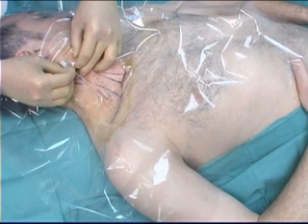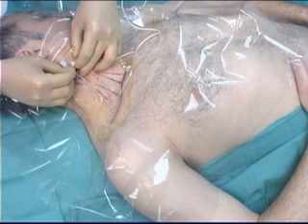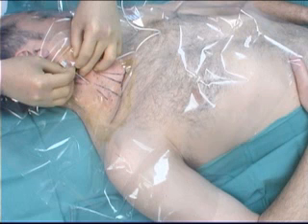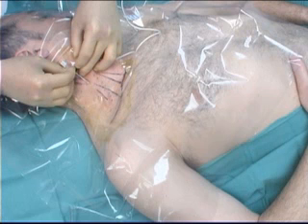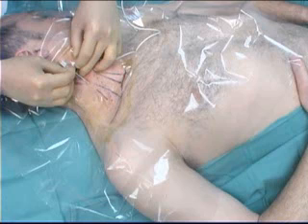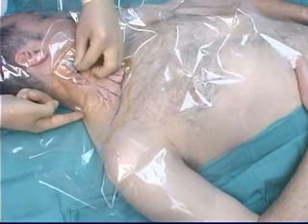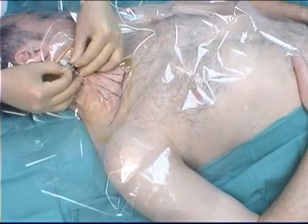The nerve stimulator can then be turned down, and a clear brisk motor response should still be present at 0.3 to 0.5 milliamps, indicating correct needle placement. It is essential that no saline or local anesthetic agent is injected through the needle at this stage, since this will make nerve stimulation via the catheter later impossible or very difficult.